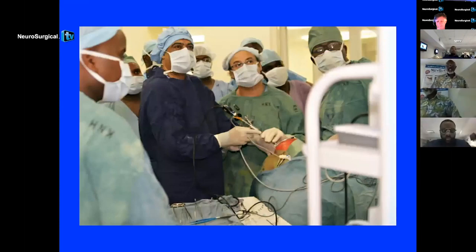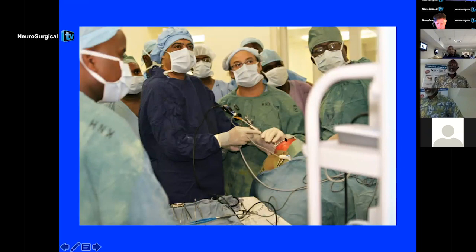Mahmoud Qureshi doing the same. Same thing, somebody securing it on the table. As he had mentioned earlier, we have excessively large hydrocephalus. Shizuo Oi called it mega hydrocephalus, and you can see on the patient's head, it is actually trans-illuminating because there's so much fluid within it.